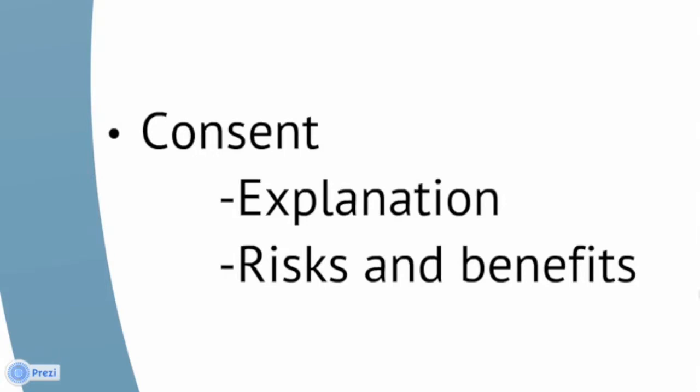In order to do this, you should provide the patient with a simple explanation of what you are going to do and why. You should also describe the potential risks, for example infection and expulsion, along with the benefits such as emptying the bladder or measuring urine output. After this, check the patient's understanding and ask if they are happy for you to continue.